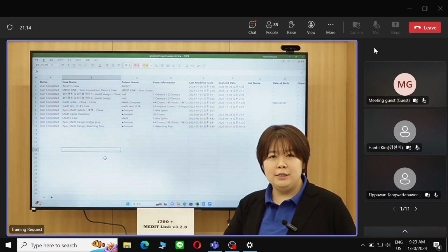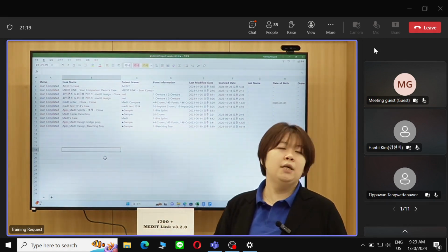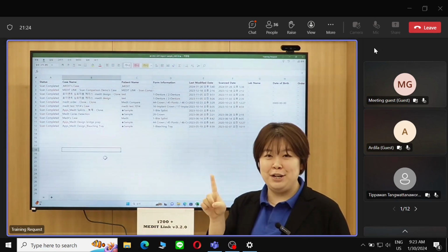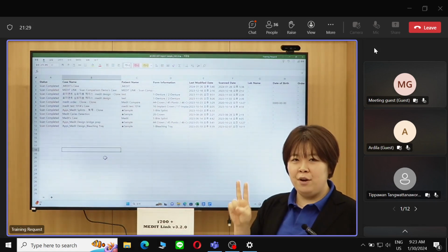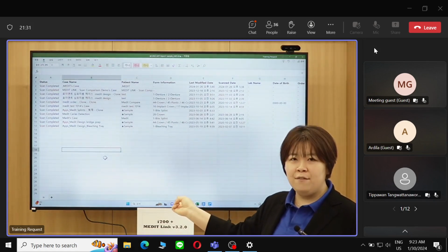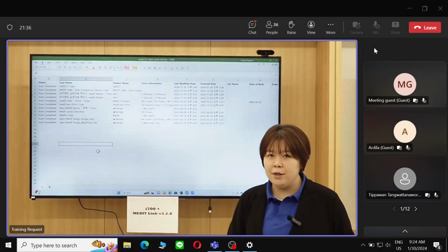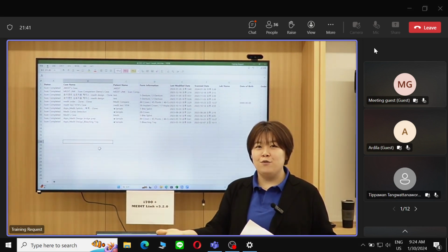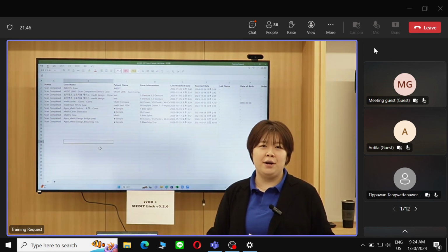So we explained these two issues, and we really wanted to keep this live demo simple and short to just say: one, improved scanning performance and experience; second, improved patient and case management. With these two things, the new MEDIT Link version is significantly better than the previous one. Once again, by upgrading the software with the same hardware, same PC, you're able to get a far better experience.